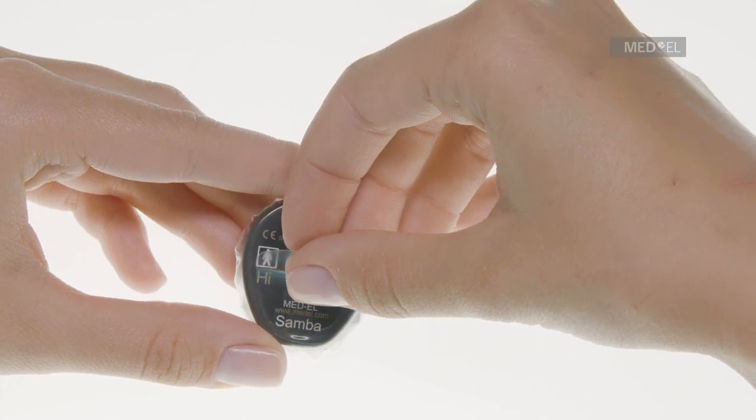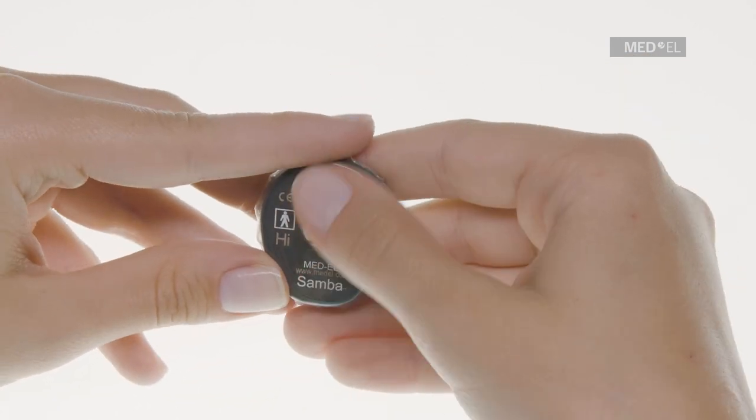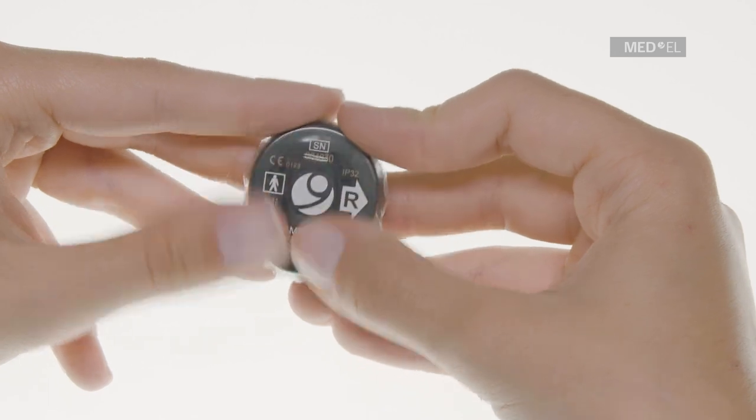Start applying the tape on the side where the battery compartment is. Make sure that both flaps of Waterwear remain flat on the surface of Samba and no wrinkles form during the application of the adhesive seal tape.